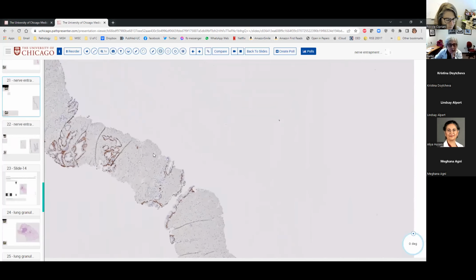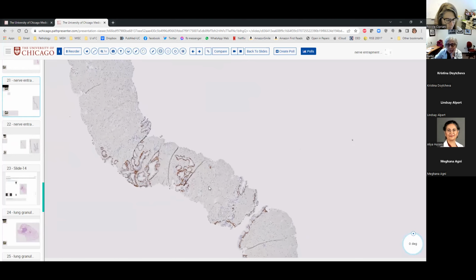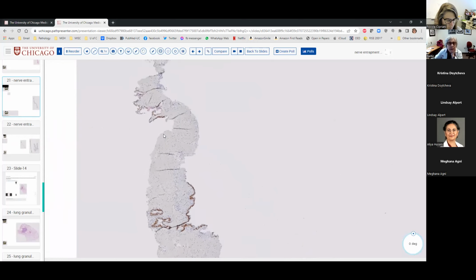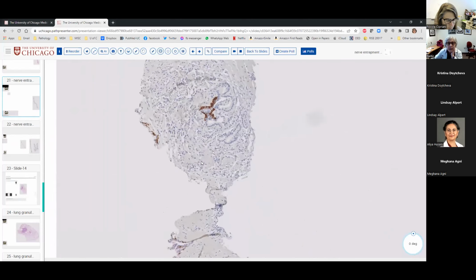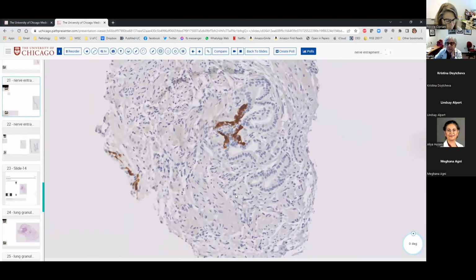And just to confirm that all these previous glands in the nice lobules are all benign. As you can see, they all have basal layer. Now we have to go to this structure here. And you can see that in this area, the basal layer is also preserved.